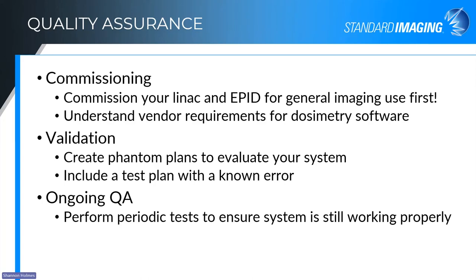That will make it a lot more smooth as well as accurate, and it makes implementation of this dosimetry software and integration into your workflow a lot easier. Once it's commissioned, make sure you go through some validation plans as well. The task group talks about creating phantom plans of various anatomical sites in order to really evaluate your system.